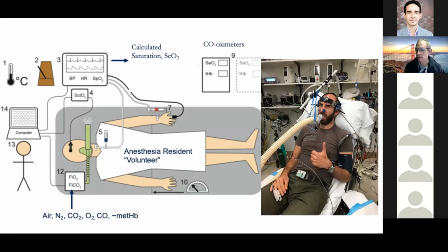Here's just a sketch of the laboratory environment. There's a subject on the right there breathing through a mouthpiece. This subject is given reduced amounts of air to breathe, and there's carbon dioxide added, and we're monitoring the oxygen level in the body breath by breath. So we're sampling end-tidal gas that we derive end-tidal carbon dioxide, end-tidal oxygen.